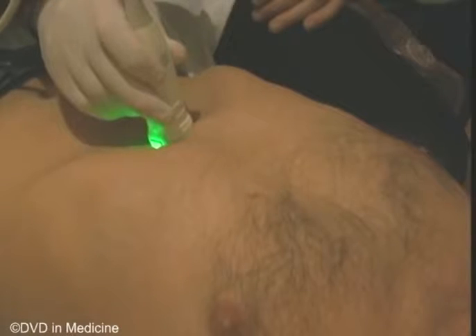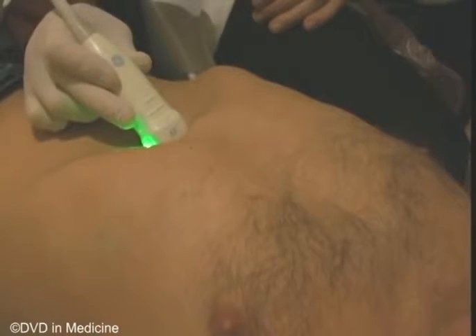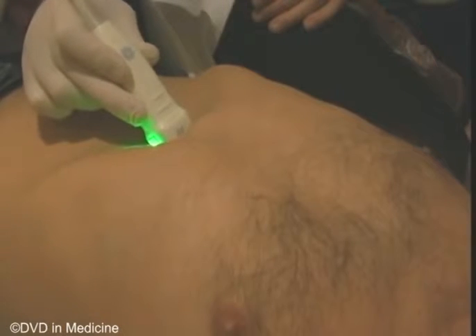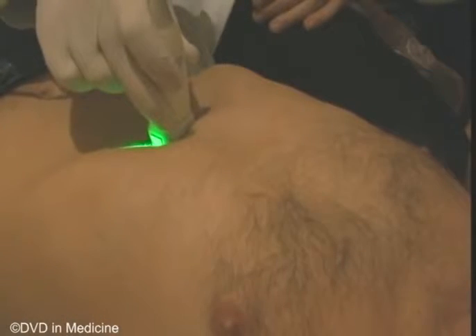The transducer should be placed horizontally in the epigastric region and the scanning plane angled upwards towards the head to obtain images of the heart structures, or downwards to obtain images of the major vessels. These vessels are the abdominal aorta and inferior vena cava. One can also see the hepatic veins as they enter into the inferior vena cava.